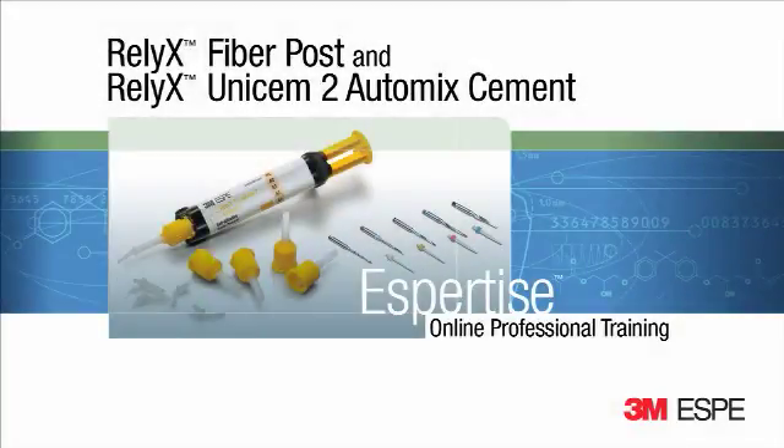The 3MSB Reliax Fiber Post System is indicated for endodontically treated teeth with significant loss of tooth structure, to increase stability and retention of subsequent coronal restorations.